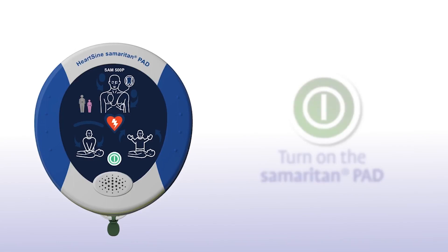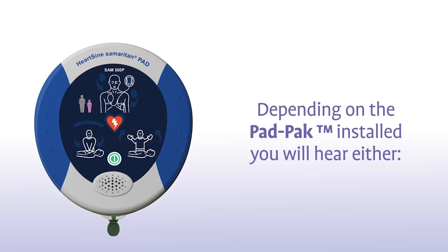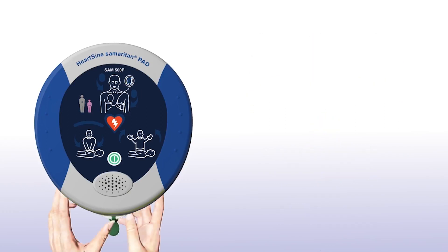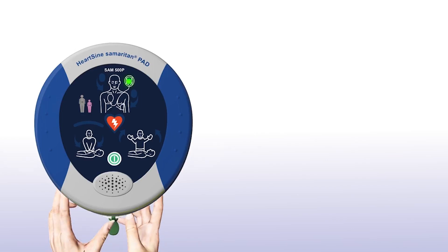Press the green on-off button to turn on the Samaritan PAD. Depending on the pad pack currently installed, you will either hear an adult patient or a child patient prompt. If the patient is a child between 1 and 8 years of age, you should ensure a pink paediatric pack is installed. If a pink paediatric pack is not available, you may use the grey adult pad pack instead.